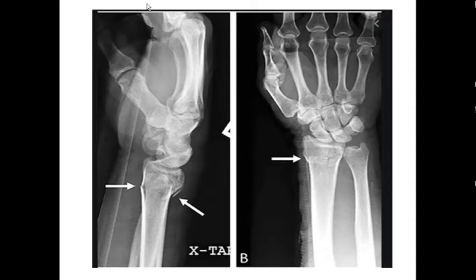No, this is not Monteggia fracture. Somebody has written Monteggia fracture in chat. Okay, Colles fracture. So what is Colles fracture? Can anyone define what is Colles fracture?